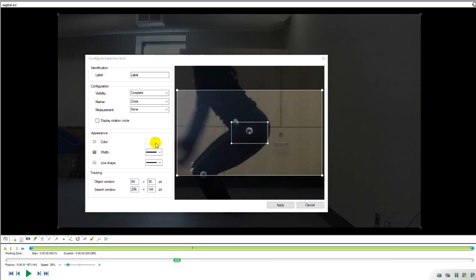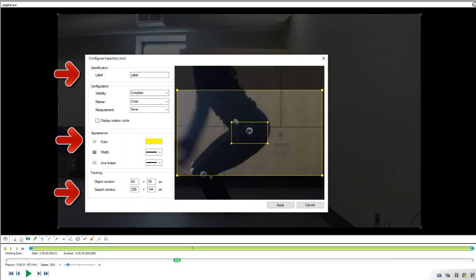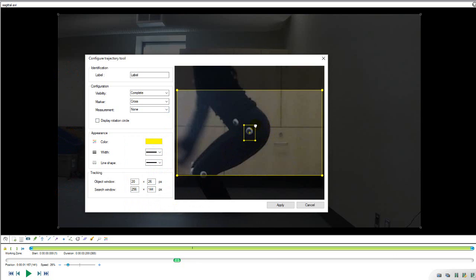In this menu you can change the color, size and title of the path. You can also adjust the object and search windows by dragging the corner of each window or manually inputting the size. This will help keep the tracking point from moving off of the marker throughout the movement.